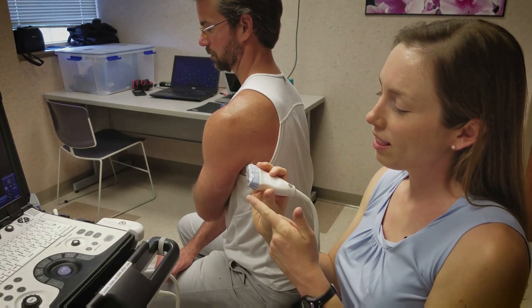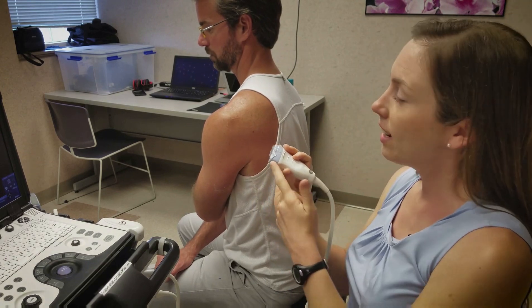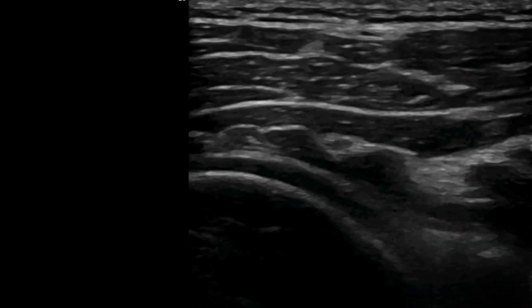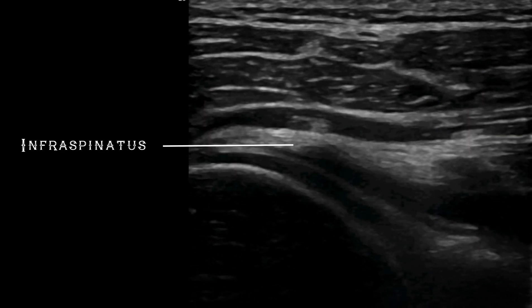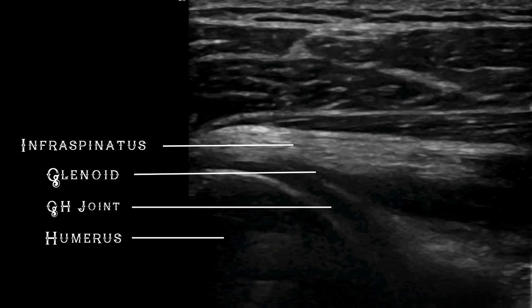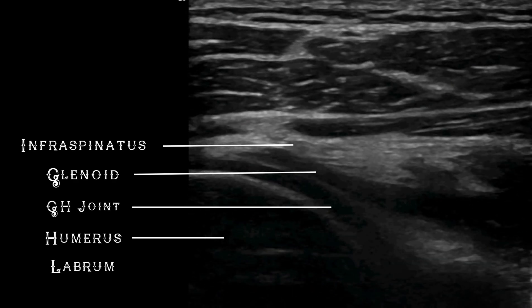Apply the probe with the transducer indicator in the lateral position. The landmarks to identify on the ultrasound are the infraspinatus muscle, the glenoid, the humerus, the glenohumeral joint space, and the glenoid labrum.